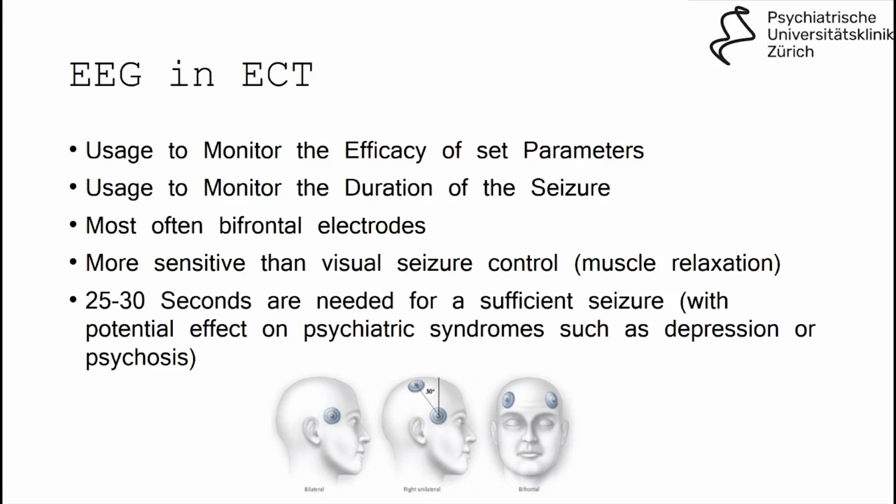So what we do is we record the EEG here in our center at two frontal electrodes. You can see it here, the bifrontal electrodes. So we don't only stimulate there, but we also record the EEG.